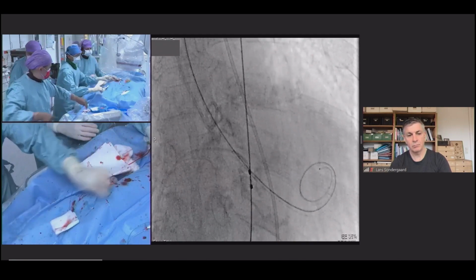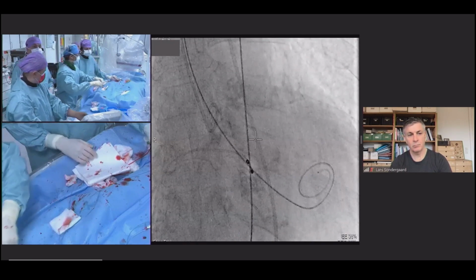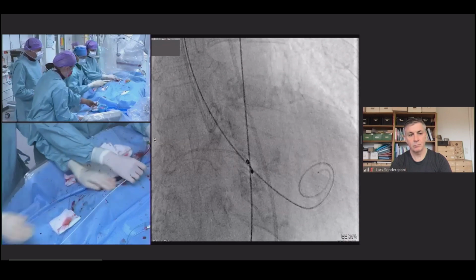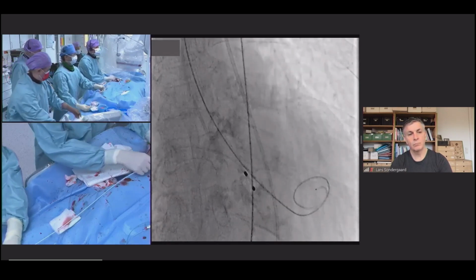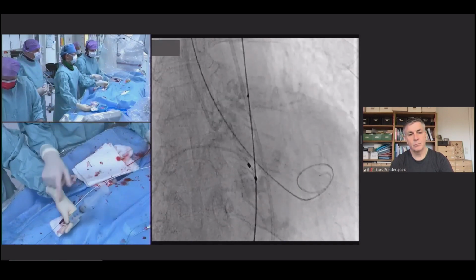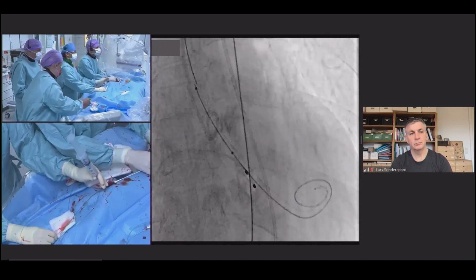And then I think we are ready for pre-dilatation. We normally respect the minor axis of the aortic valve, and in this case it was 20 millimeters. So the balloon is a 20 millimeter balloon. This one is from Osypka. And we can do pacing in a minute. We can pace at 160, max output here, and start pacing.